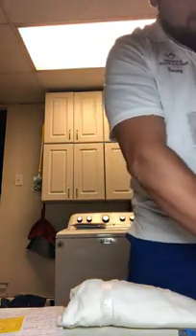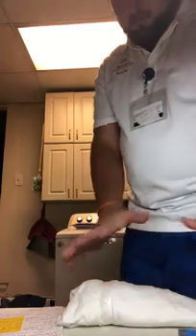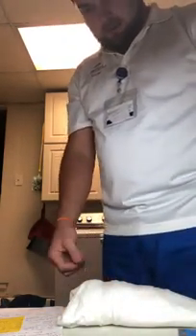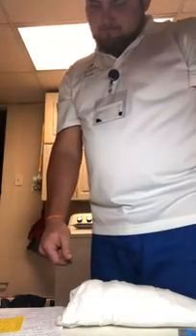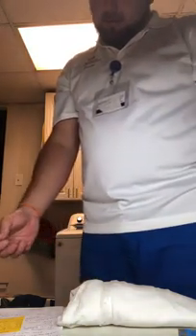And we're going to get the gauze out and dab that if we need to, if it's bleeding, and stick a Band-Aid on it. Okay. How do you feel? Everything's okay. The injection site looks a little red, which is to be expected. Now we're going to be doing the SubQ.